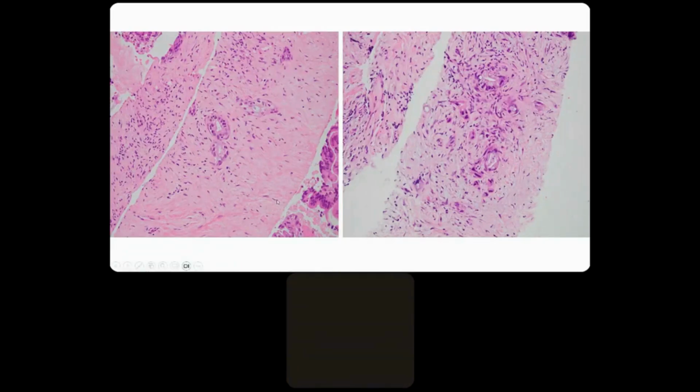And this bears out what I was saying, is that you've got a fibrous stroma, or desmoplasia if you like, and then you've got ducts that are embedded within it. There are desultory inflammatory cells strewn throughout it focally. Now, if this was chronic pancreatitis, this could be very much in keeping with the stroma that you see with it because there's inflammation, but generally you get a bit more inflammation. But the key here is the distribution of the ducts.